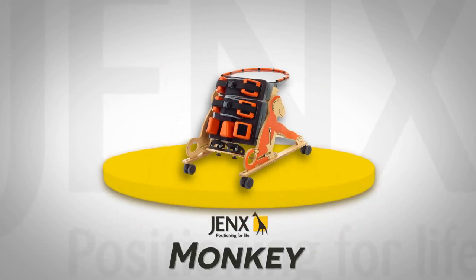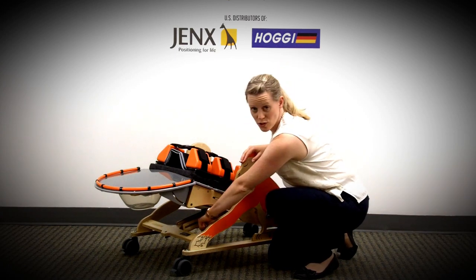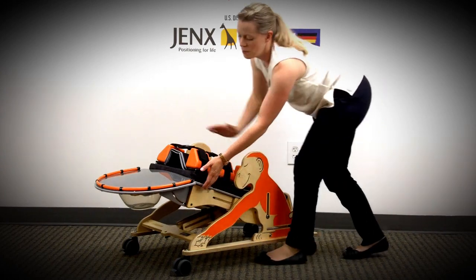The monkey is now in its most prone position. To adjust the angle of the frame, loosen the wing knob on the diagonal strut at the front of the frame and pull up.